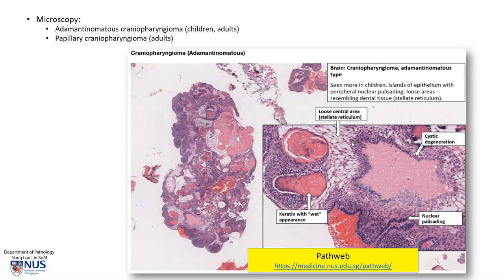This is an example of an adamantinomatous craniopharyngioma. On imaging, there may be cystic areas or areas of calcification. What we see here are islands of squamous epithelium with peripheral nuclear palisading, meaning the nuclei at the edge form a row of very nicely lined up nuclei. There is also often a loose area where the cells form a spongy network, and this is called stellate reticulum. In addition, there are areas of anucleate keratinized cells, and these compacted cells are known as wet keratin. So this tumor often has areas of cystic change.